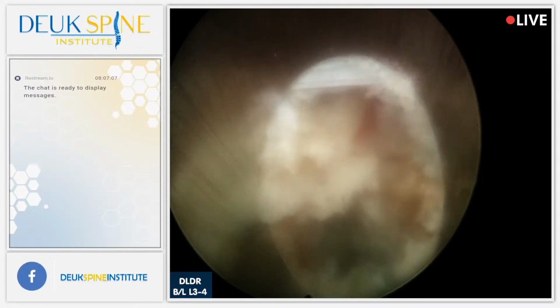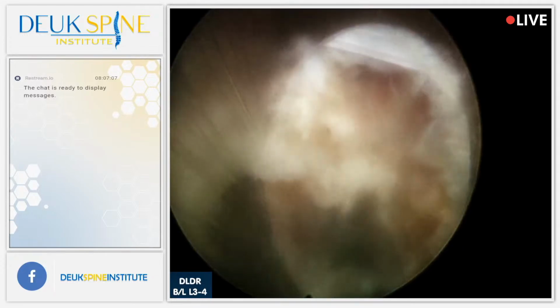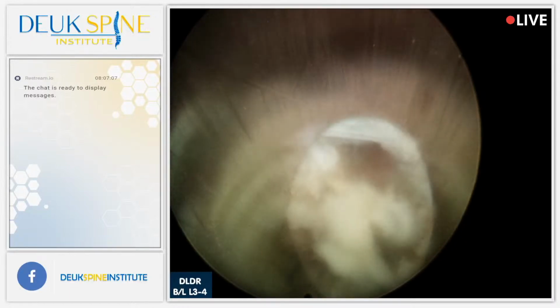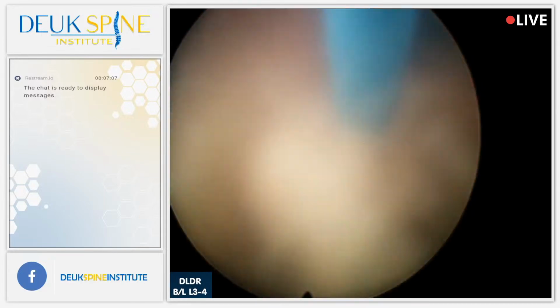So I'm going to turn the tube and scope and look north. North means to the left. There's some more herniation right there. Lots of pieces of herniation coming out. By the way, did you notice how the herniation just danced itself out?